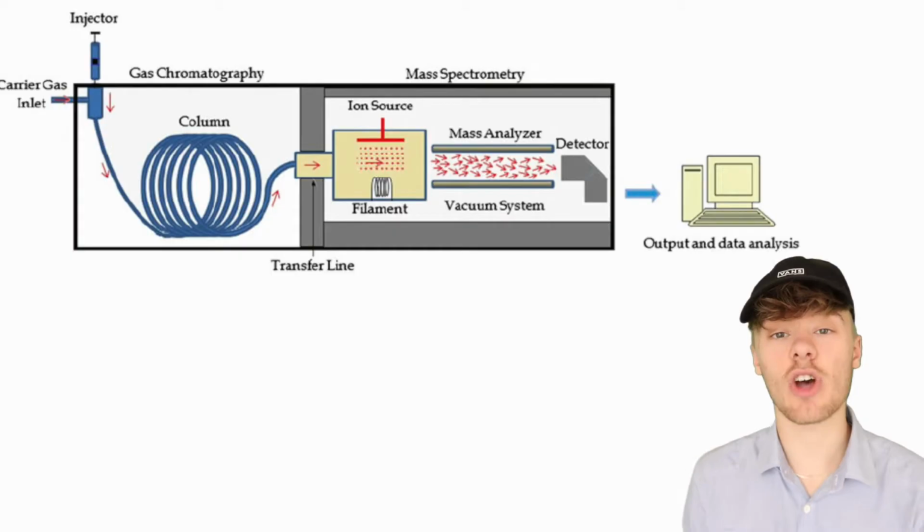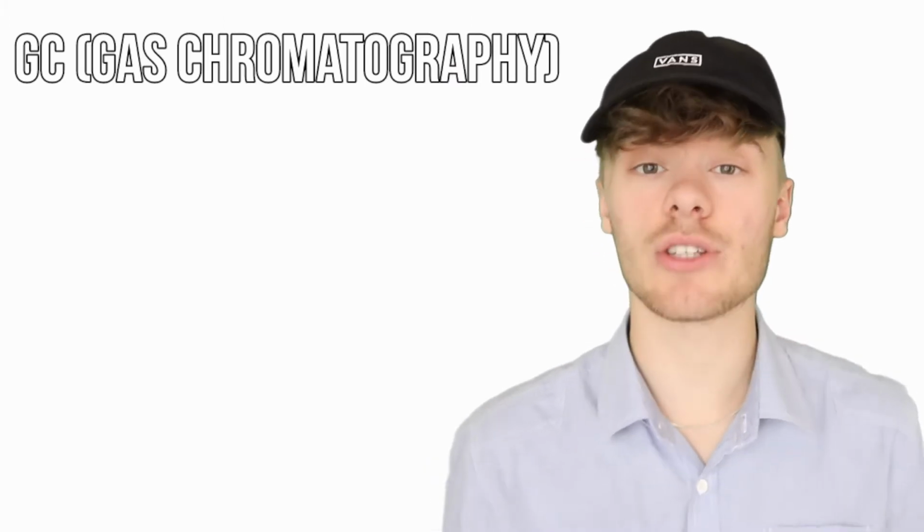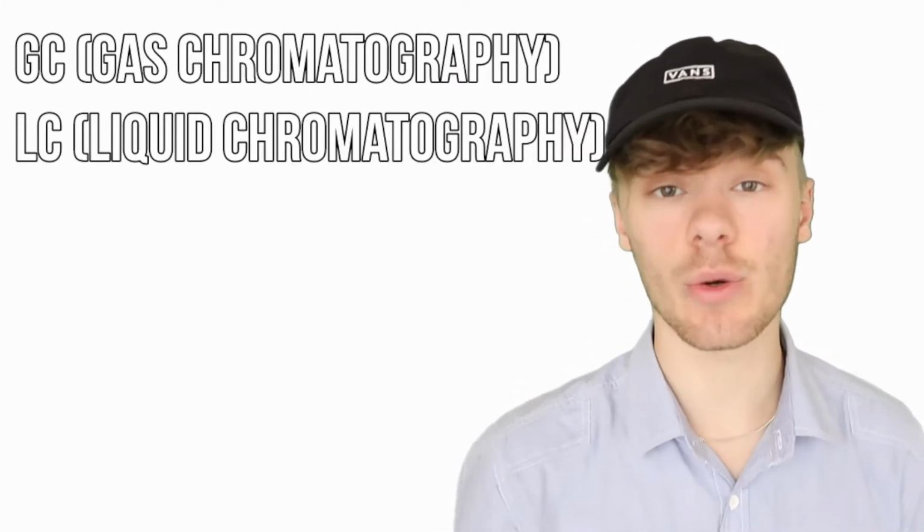Now, to allow for an increased specificity of the mass spectrometer, it is commonly coupled with a chromatograph, and this can be seen in labs globally. However, which chromatographs are they coupled with? The most frequently used are that of two types. The first is GC, or gas chromatography, and the second one is liquid chromatography.